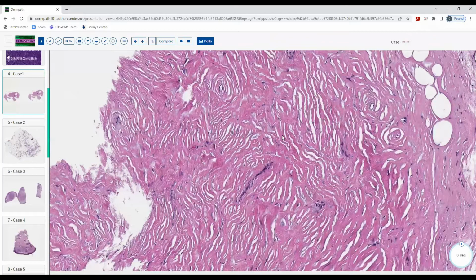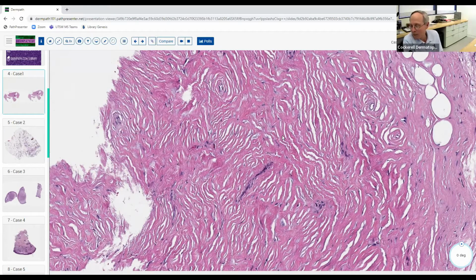It looked like it could be vascular space. I don't see any linings or anything, but some type of mimicking of a vascular lesion or something. I don't know. But yeah, if you haven't seen this, you might not know what it is. Somebody's chiming in there, have an idea? Are you talking about the collagen bundles, like the Van Gogh starry sky kind of? Yeah, you could possibly call that starry sky, like these little things over here a little bit.